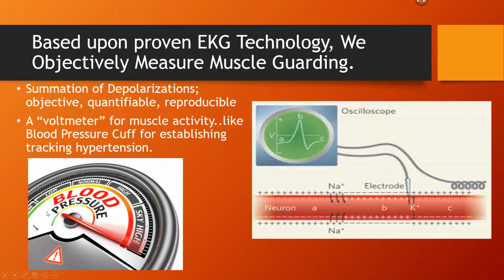Plus, they feel like they've spent a lot of money on all different kinds of tools, on different kinds of docs, and the whole world is going to this evidence-based model. They recognize it, and they recognize the importance of it, and there's no better way than using the DynROM EMG for proving that.